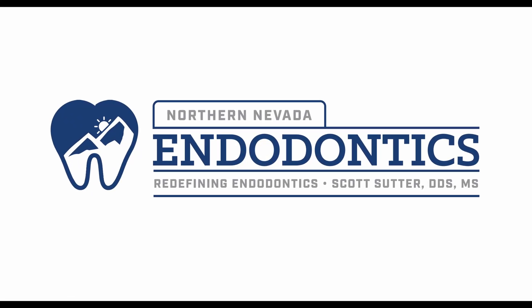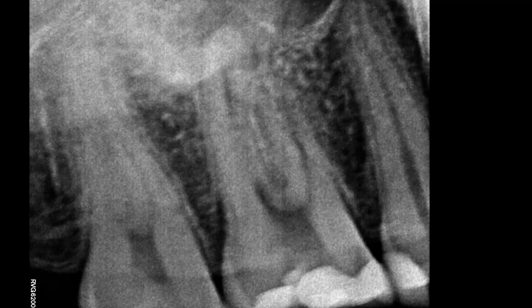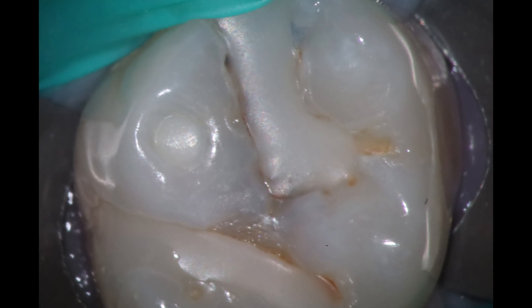Hello everyone and welcome back. Kind of a normal looking tooth today, but wait until you see what we got on the inside. You can see a little bit of recurrent decay on number three there, and very visible — you can see that ugly, ugly looking composite, just exactly what you want to see.